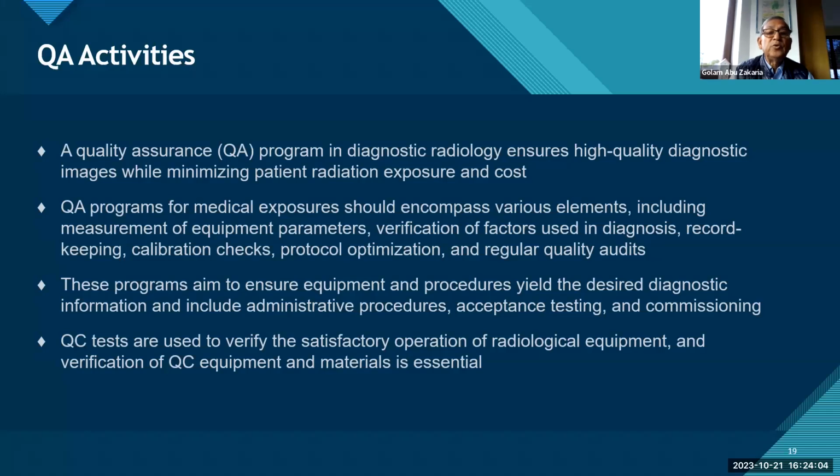This program aims to ensure equipment and procedures deliver the desired diagnostic information and includes administrative procedures, acceptance testing, and commissioning. Acceptance testing is not only for radiotherapy, also for diagnostic. After the installation, there is an acceptance testing and also commissioning. And after the commissioning, you have the quality control parameters fixed, and this should be done for the whole life of the machine.